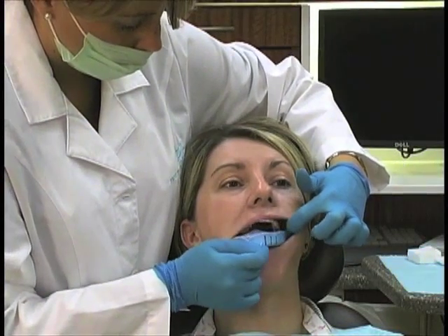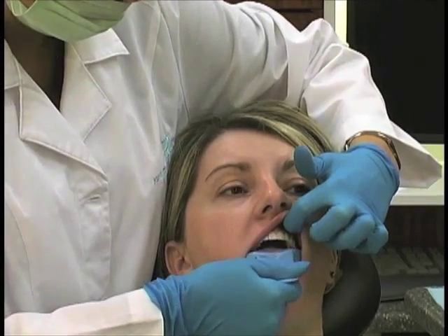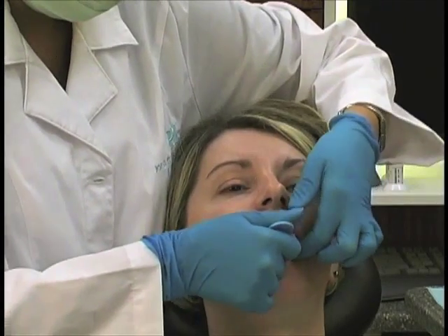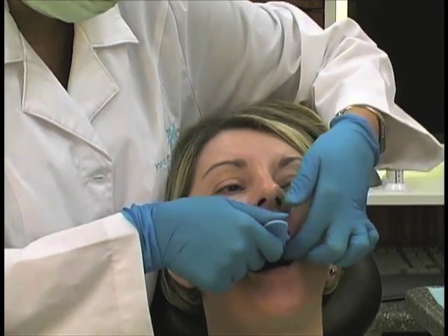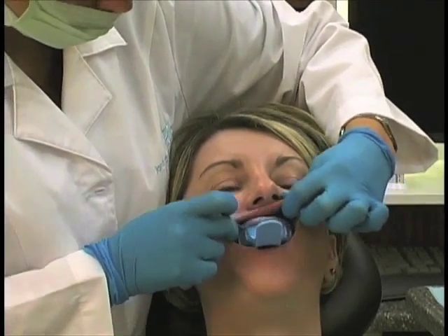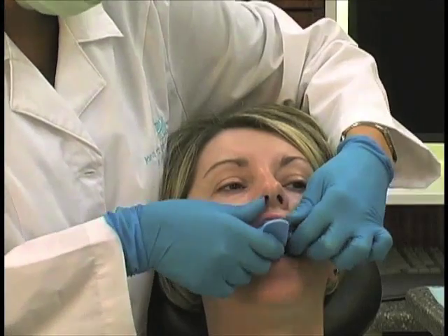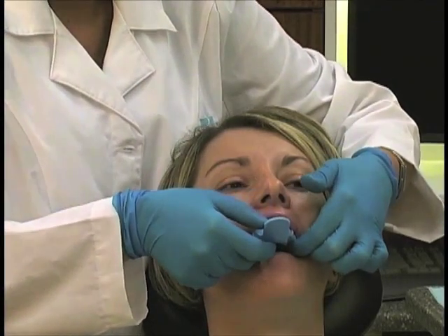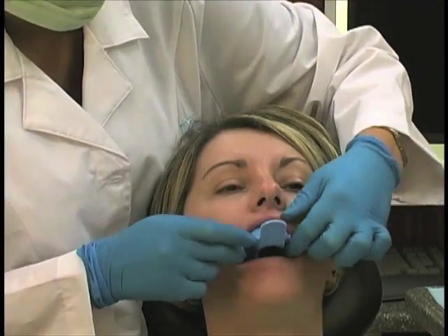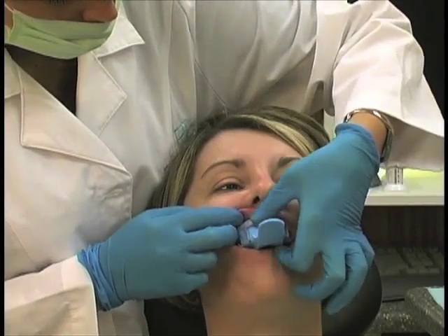Again, from this view, for the upper, you're going to be standing behind the patient. And go ahead and seat this straight up, maybe a little bit more towards the second molars first. But again, this stuff's fairly thick, so you're going to have to give it a good seating, pull the lip over it. You can actually kind of push from the outside and feel that material being extended all the way up.